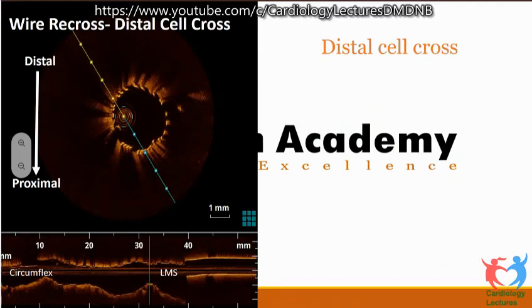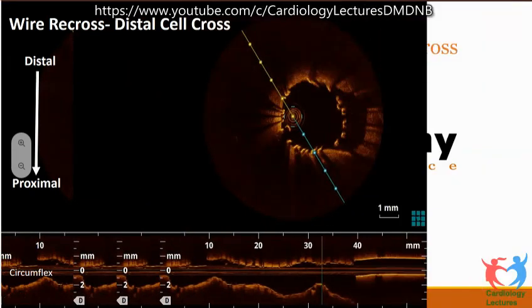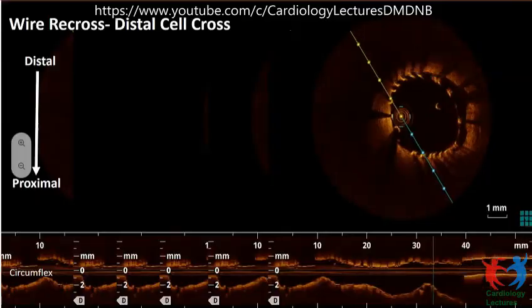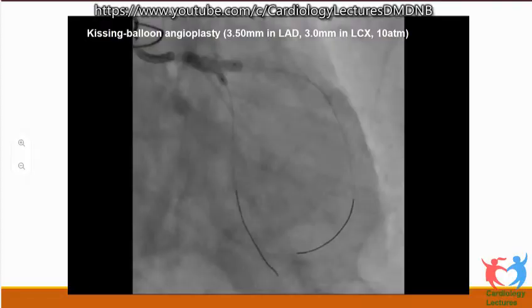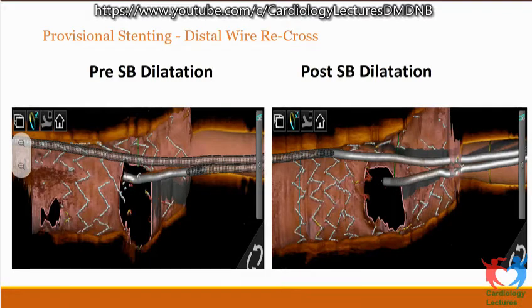We also check for recross with the wire. Here you can see there is one wire into the side branch, and as we are coming from the proximal, this wire is now coming in. So through the distal strut, the wire has now just entered. Having crossed that, we chose a 3.5 and a 3 balloon. Did the kissing. Now this is a 3D view.